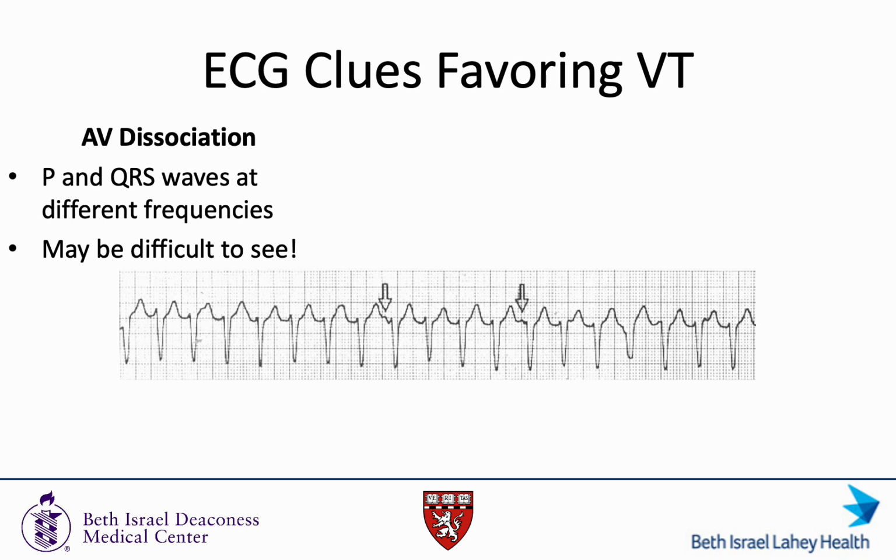As an additional exercise, try to find the additional P waves. I found at least two. Here are the two that I found.